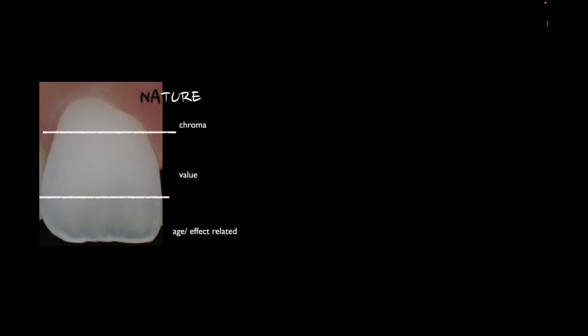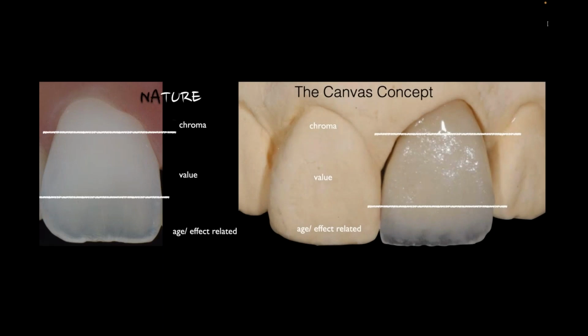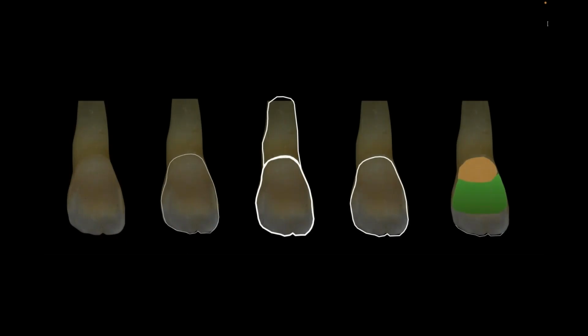And as I get down to the incisal edge, I want to mix and match them. I might want some translucency, I might want some filtration where I'm not getting all the light going through. It really depends on the effect that I'm looking for. So as I build my canvas, I'm going to pick and choose my enamels based on the goal that I'm looking for. Light transmission or light reflection is really the kind of goal that I'm working through.